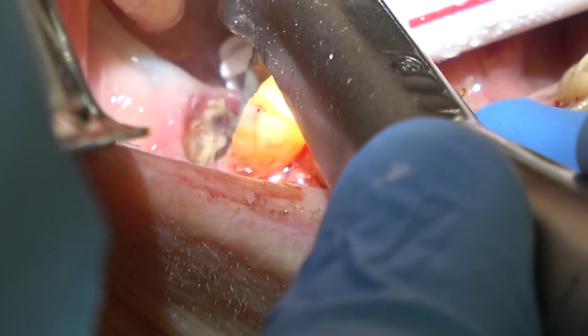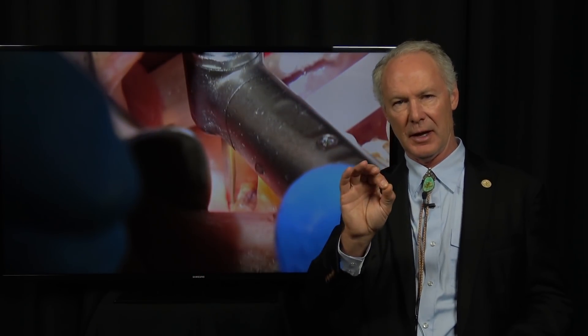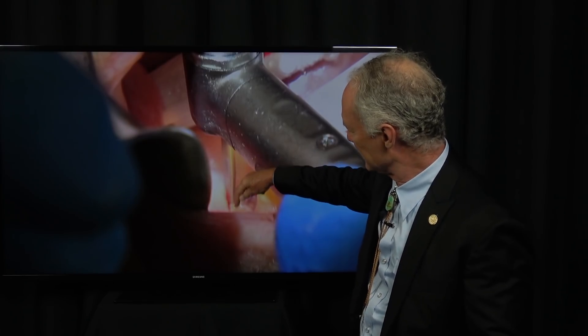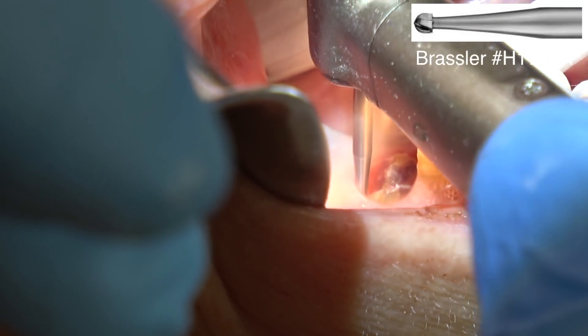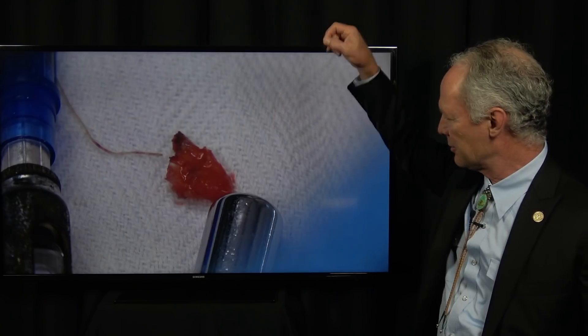See, I'm cutting facial to lingual. And then with this round bur I'm making a little cut on the distal of that distal root so I have a purchase point for my elevator. Since that root is broken off flush with the alveolar crest, you don't have a purchase point for an elevator. So I want to move that root mesial and distal — I don't want to take it out to the facial because I'll lose the facial or buccal bone plate. Cut just a little trench in the distal of that fractured root and then you can place an elevator in there and gently move it mesially, then place an elevator in the section area and move it distally.